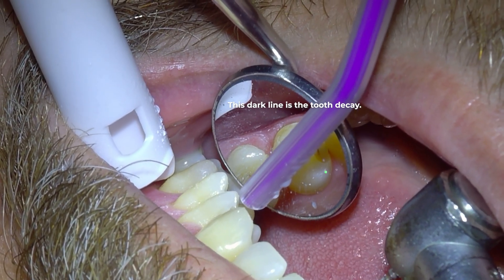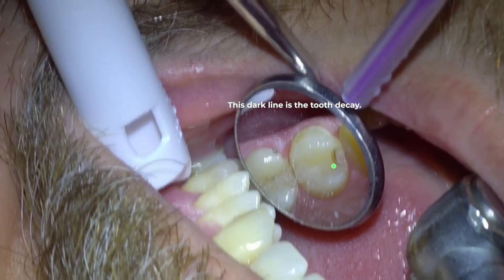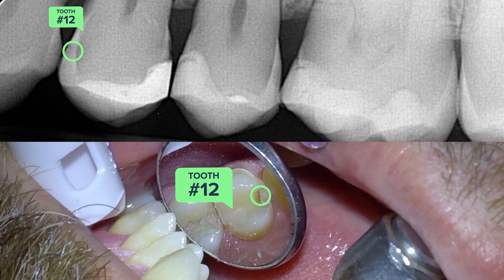The small dark line you see here is the decay in the front side of tooth number 12, which has made its way past the enamel layer. For reference, I'm going to show you the cavity again on the x-ray so you can see what it looks like and compare it to what it looks like in the mouth.